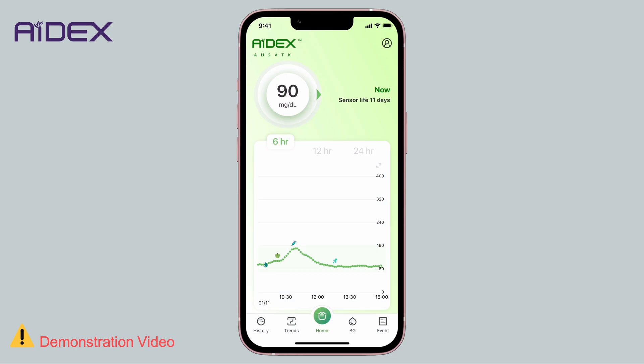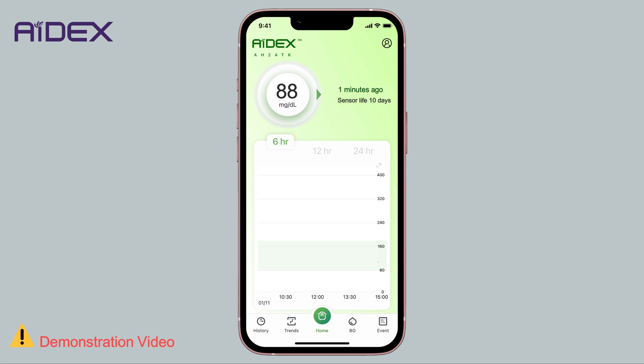You will also observe a shaded green area representing your target range, and we will explain how to configure it. Adix readings are updated every 5 minutes.